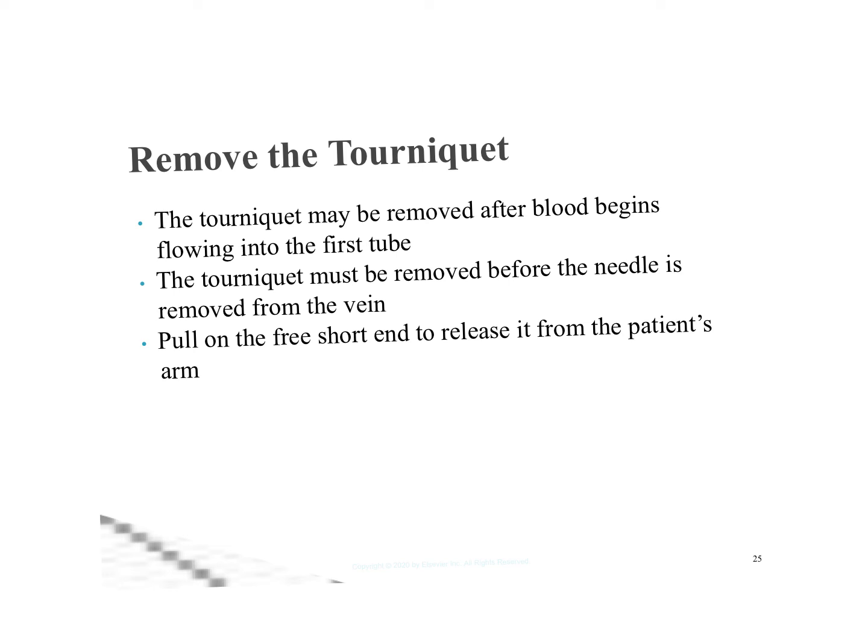Again, we need to pay attention to our time limit because we don't want to leave that tourniquet on longer than a minute. So we should be paying attention to that, but we don't necessarily always take it off as soon as we start that collection.